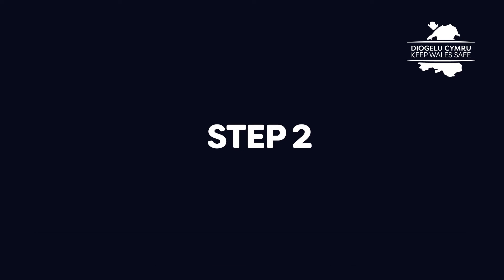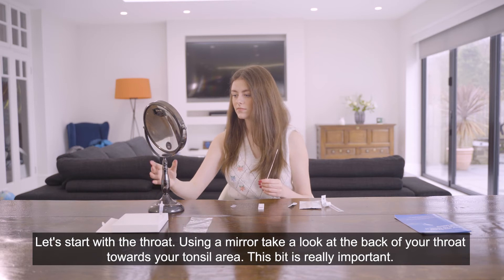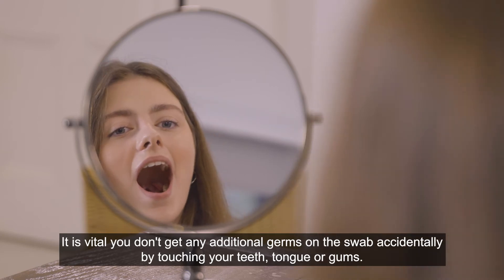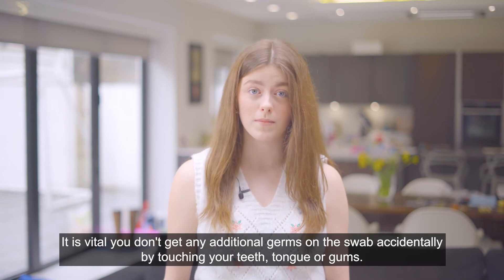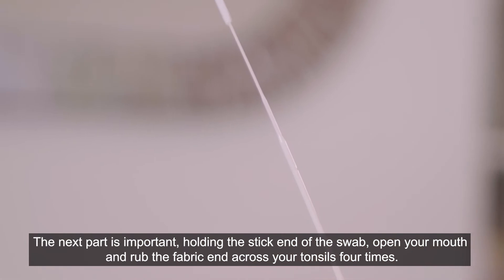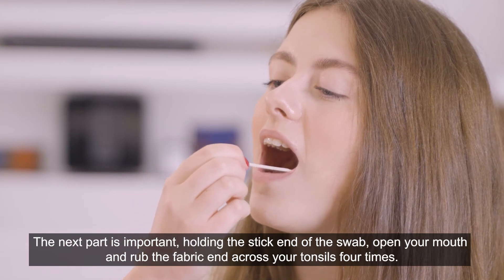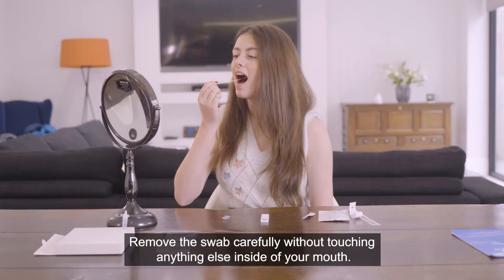Step 2, let's start with the throat. Using a mirror, take a look at the back of your throat towards your tonsil area. This bit is really important — it is vital you don't get any additional germs on the swab accidentally by touching your teeth, tongue or gums. Holding the stick end of the swab, open your mouth and rub the fabric end across your tonsils four times. Remove the swab carefully without touching anything else inside of your mouth.